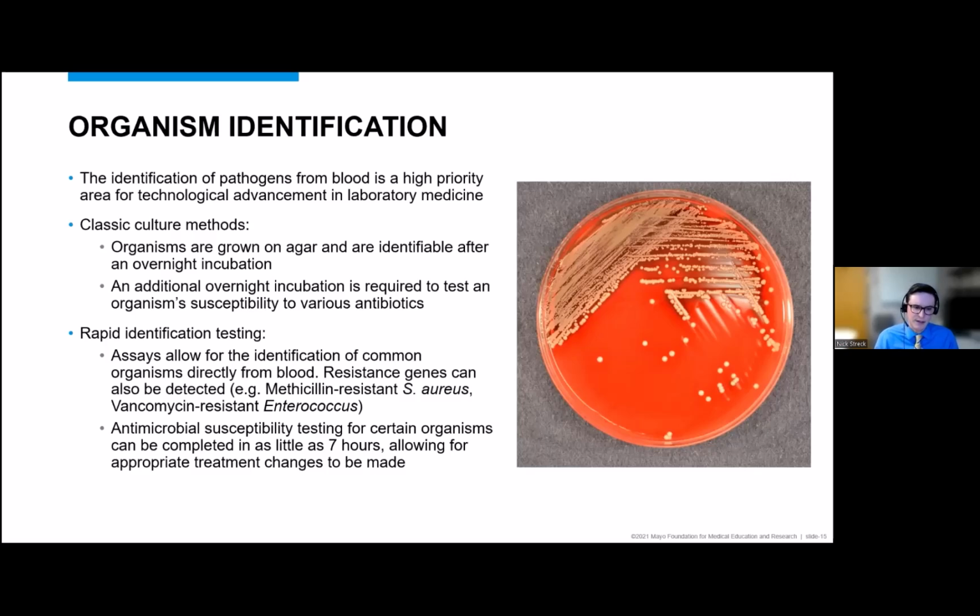So you can see that still takes some time to get that information to the healthcare providers. So one area of major growth in the microbiology laboratory is the implementation of new technology and rapid testing for blood cultures, to help get that information out to the providers faster than it takes for those classic culture methods.